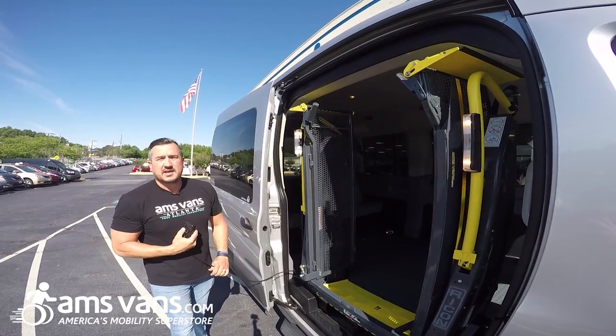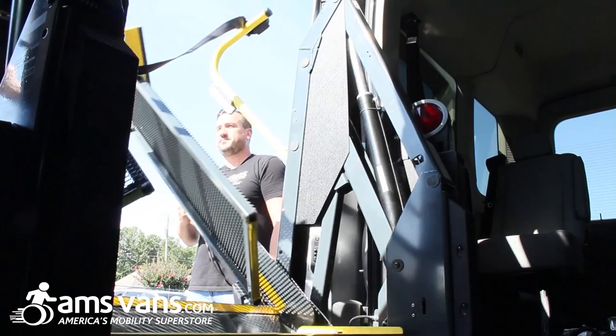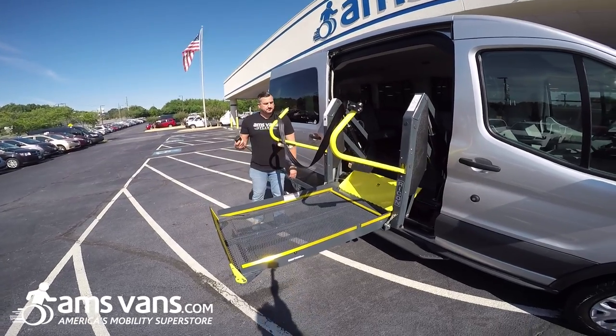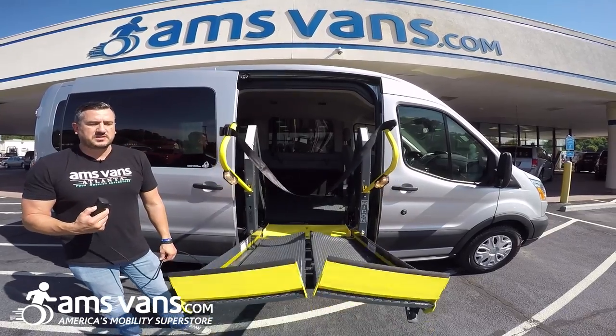Whenever you deploy it, it does fold into a full platform lift. Go down, and then when you stow it, it folds in half.